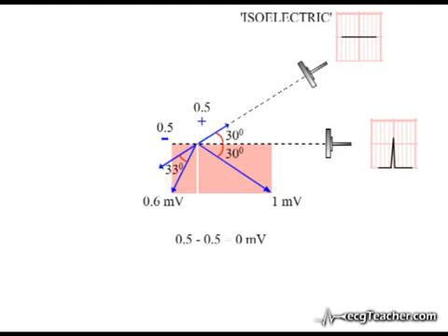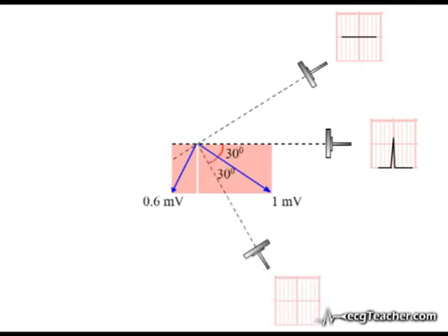Although significant depolarization voltages are present under the lead, the pattern of flow is such that the total vector generated has no net effect in its direction. In a third lead, positioned 60 degrees clockwise from lead A, these events produce a deflection with a very different morphology.